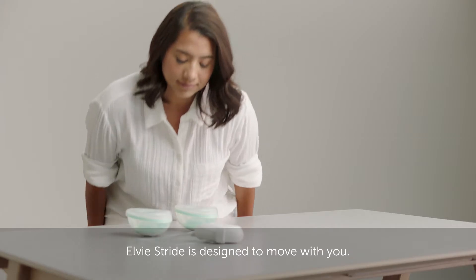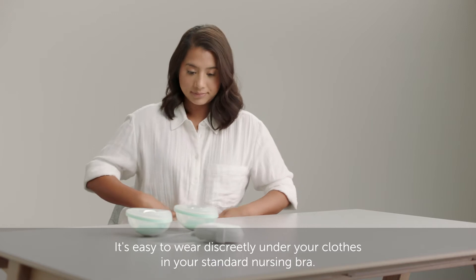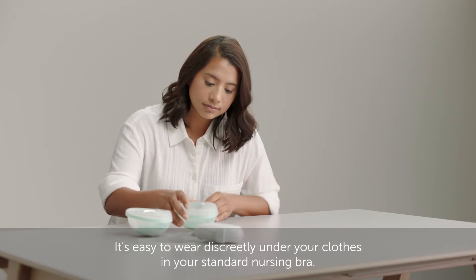Elvie Stride is designed to move with you. It's easy to wear discreetly under your clothes in your standard nursing bra.